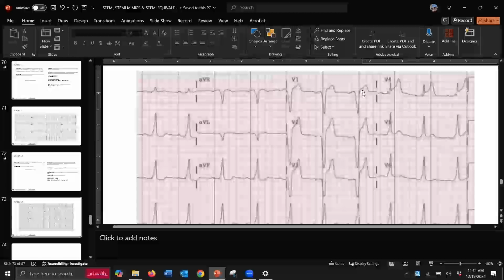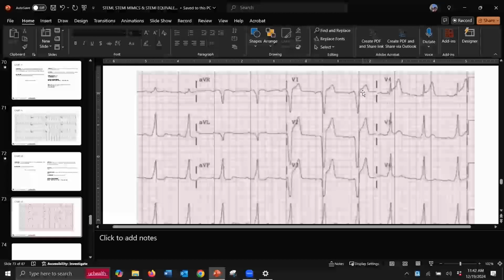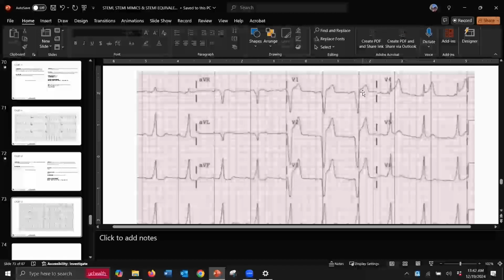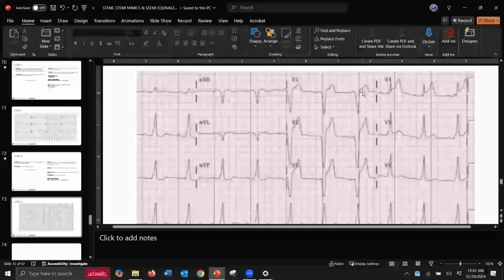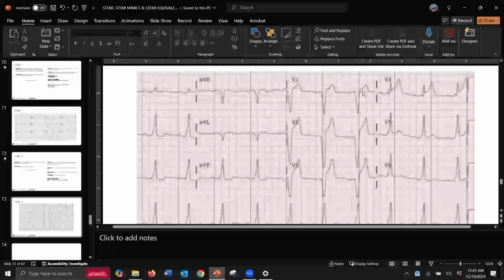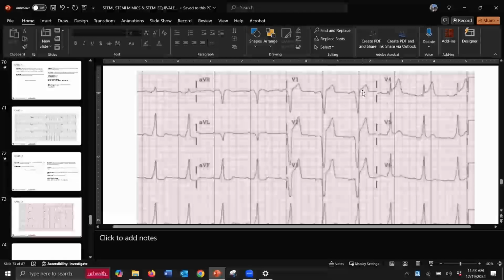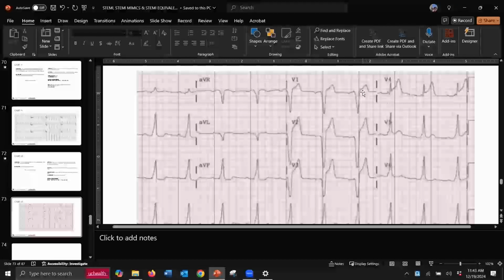All right, kids. I have many cases. Hopefully you got a little something out of this. I want you to leave with this. What we use, whether it's Zoll, Physio, Tempus, Philips, who cares? That cardiac monitor means something other than a check box on our run form. Look at every piece of clinical data that machine provides us with. Look at 12 leads a little bit differently.